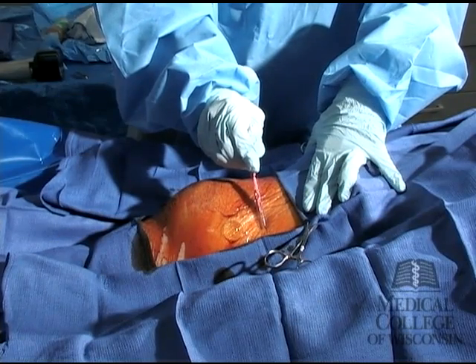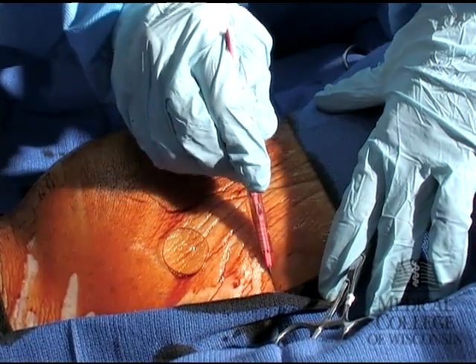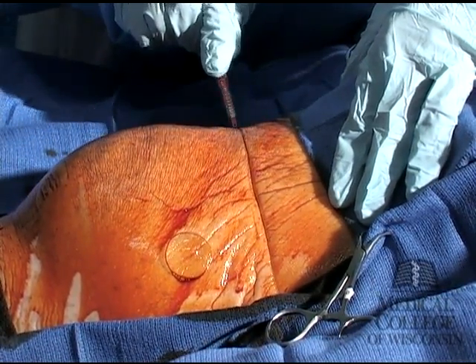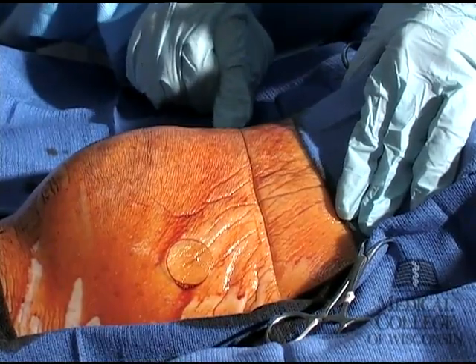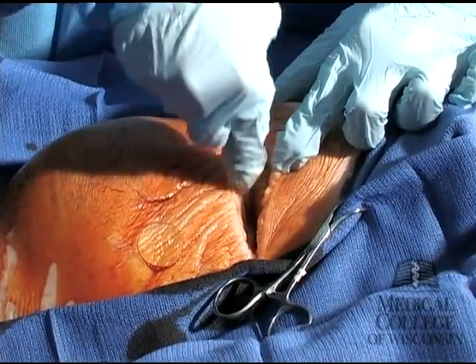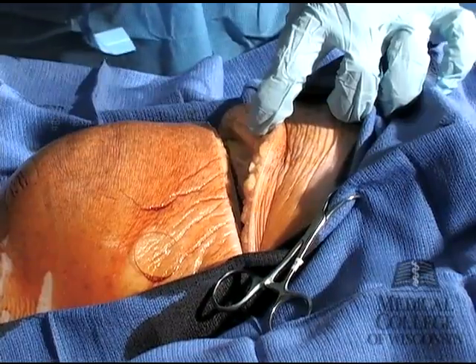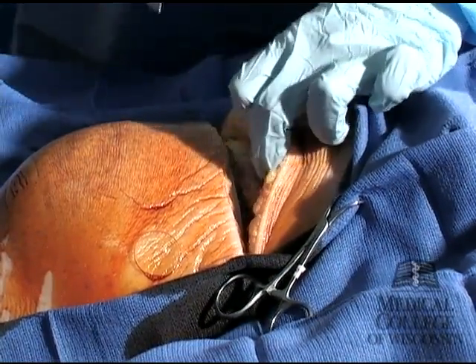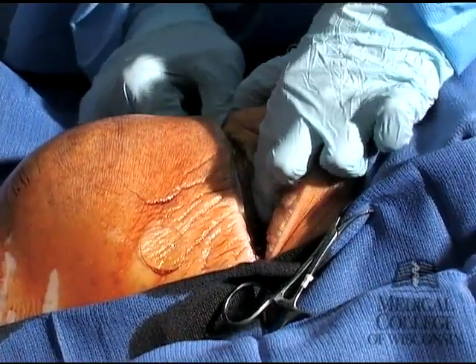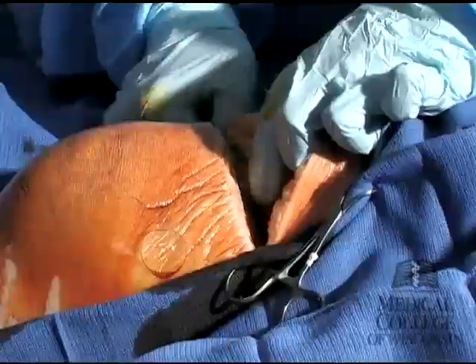Next, using the scalpel, incise the soft tissue medially and extend the incision laterally as far as possible. The tissue is then incised down to the bone. Place a Kelly clamp directly beneath the bone. Maneuver the clamp back and forth to help facilitate dissection and provide space between the bone and soft tissue.